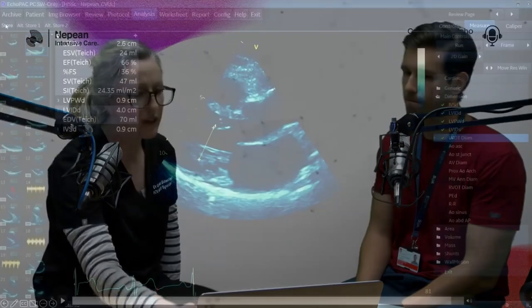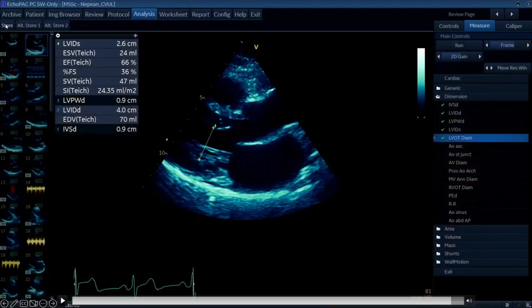If there are any regional wall motion abnormalities or changes in contractility - say things like Takotsubo where you've got hyperdynamic basal segments - then it's going to flatter the systolic function of the LV. The normal value for fractional shortening is around 36% - this is a normal left ventricle. Anything less than 25% is pitched as being abnormal.